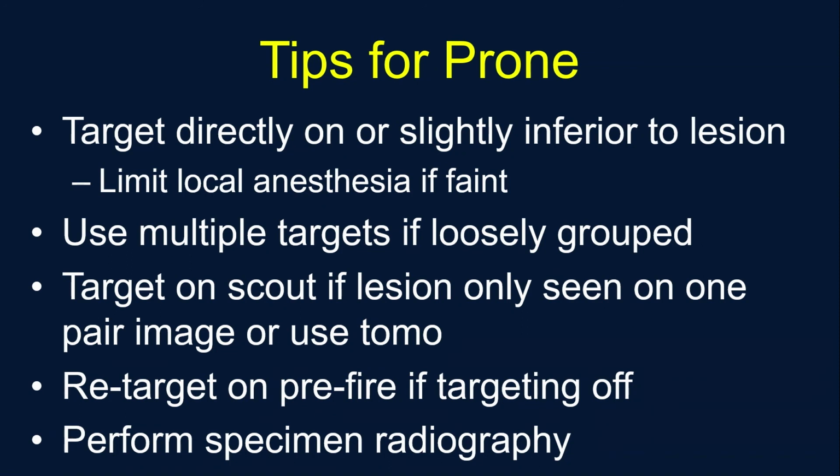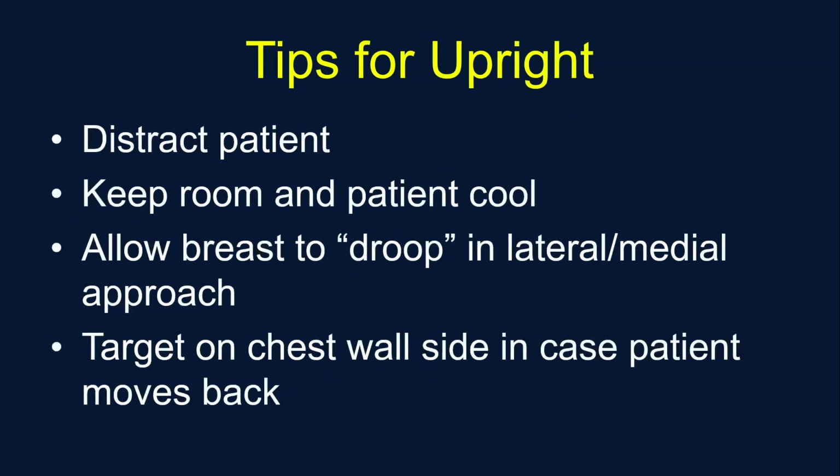You can retarget on your pre-deployment or pre-fire image if your targeting is off, and it's important to do that so that you're on target when you're in the post-deployment mode. And then, definitely perform specimen radiography to confirm that you've gotten your target.